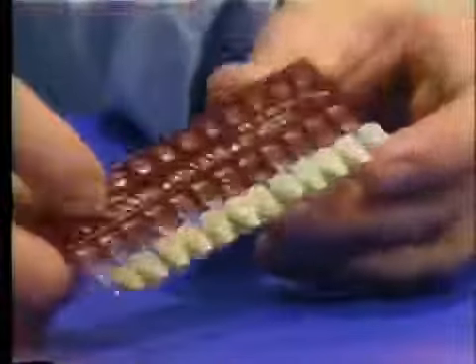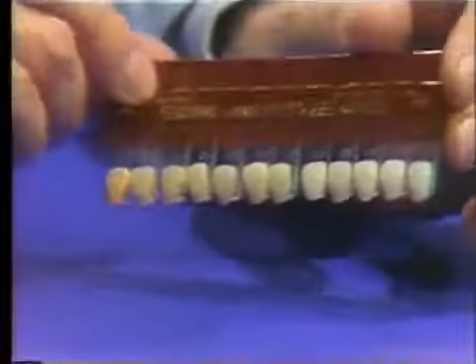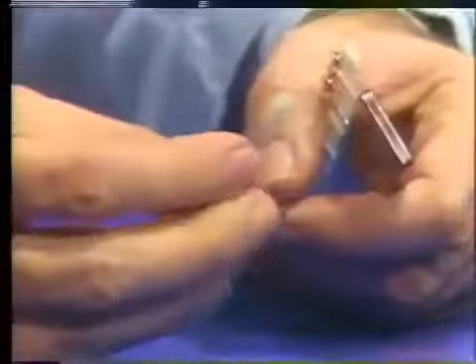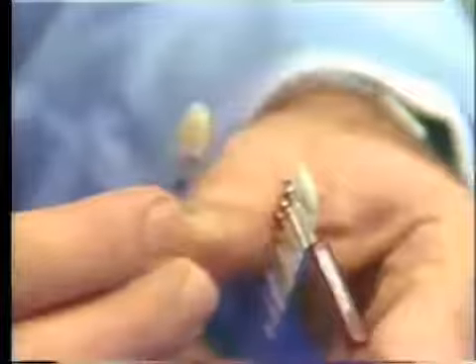These teeth are made in all the shades of the Bioform shade guide, and this Bioform shade guide, running from shades 59 through 82, is utilized to select a particular shade for any patient. These, of course, are detachable in the usual manner of shade guides and can be carried into position in the mouth and placed alongside adjacent teeth so that the shading can be checked and adjusted. Once that shade number is decided upon, it is recorded in the patient's record and is available in the selection of the facings that are going to be used in the construction of the bridge.